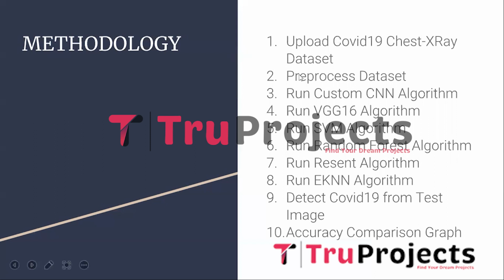And the second one is pre-process the dataset. In this module, the images from the dataset are processed. The module reads the pixel values of each image and performs the normalization and resizing operation to ensure that the images are in a format acceptable for input to the CNN model. In this project, the images are resized to the dimension of 64 x 64 pixels.